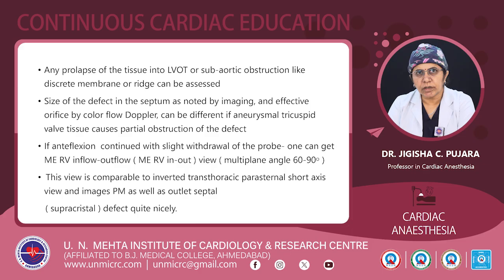If anteflexion is continued with a slight withdrawal of the probe, one can get the mid-esophageal RV inflow-outflow view. The multiplane angle here will be 60 to 90 degrees, somewhere around 70 degrees. This view is comparable to the inverted transthoracic parasternal short axis view and images the perimembranous VSD as well as the outlet septal, or supracristal, defect quite nicely.